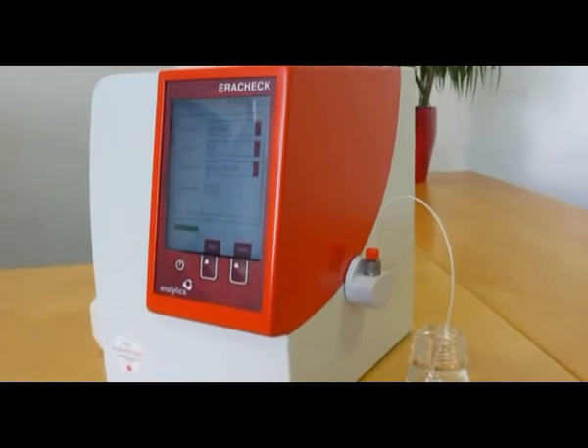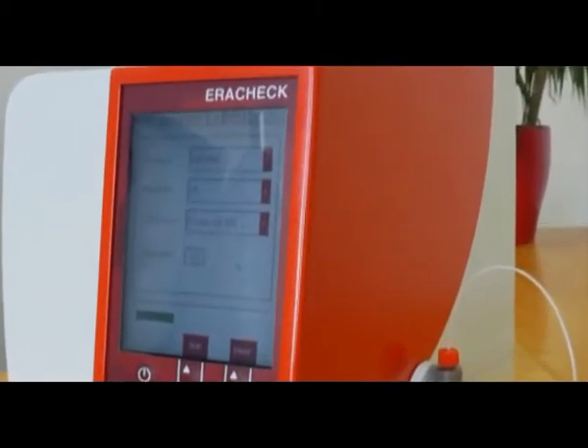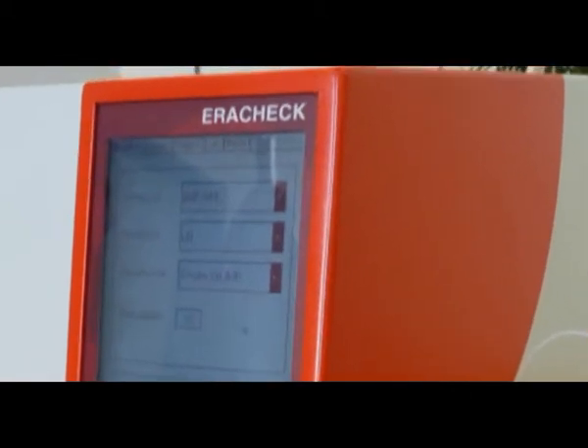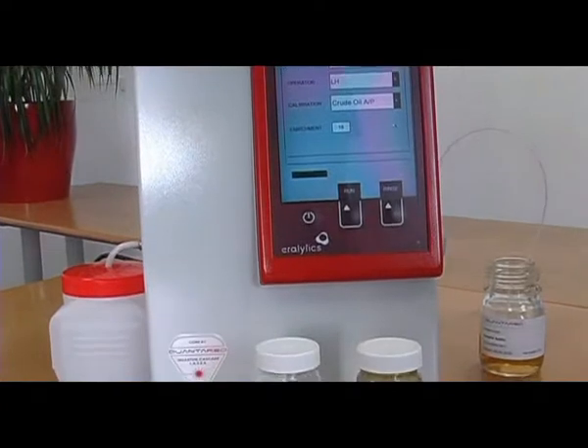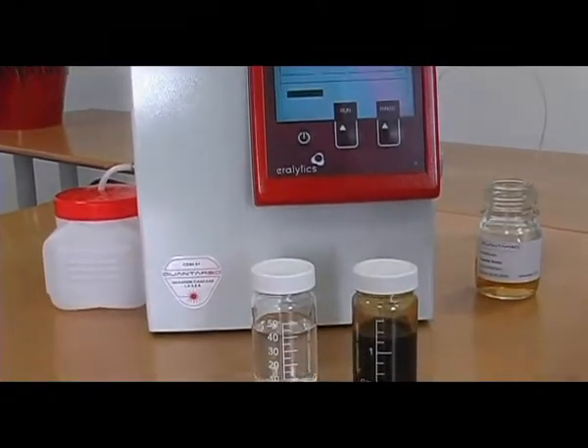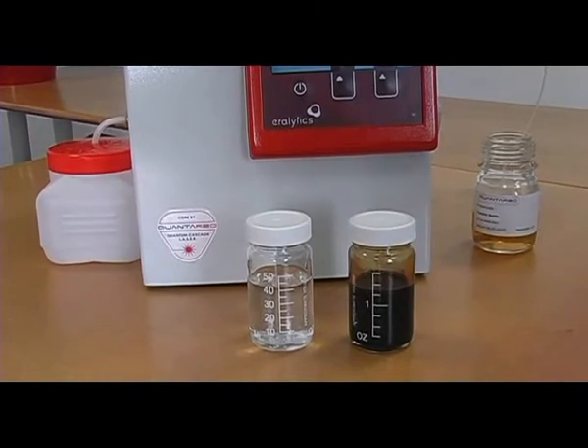The ERACHECK Oil & Water Analyzer precisely quantifies the concentration of petroleum hydrocarbons in water. Based on IR laser technology, the ERACHECK is portable and operates CFC-free. It covers all types of oil, from condensates to heavy crude oils, from dissolved to dispersed.